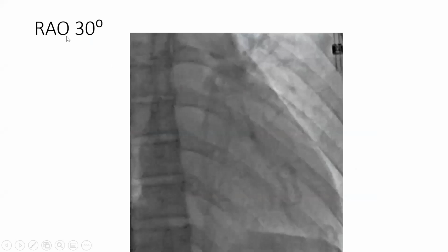And here is our RAO view, 30 degrees, that we look at in the cath lab, and we can imagine here where the RVOT is. So in this RAO view, the spine is here, the atrium is posterior, the right and left atrium here. This is the annulus, and this is the ventricles.